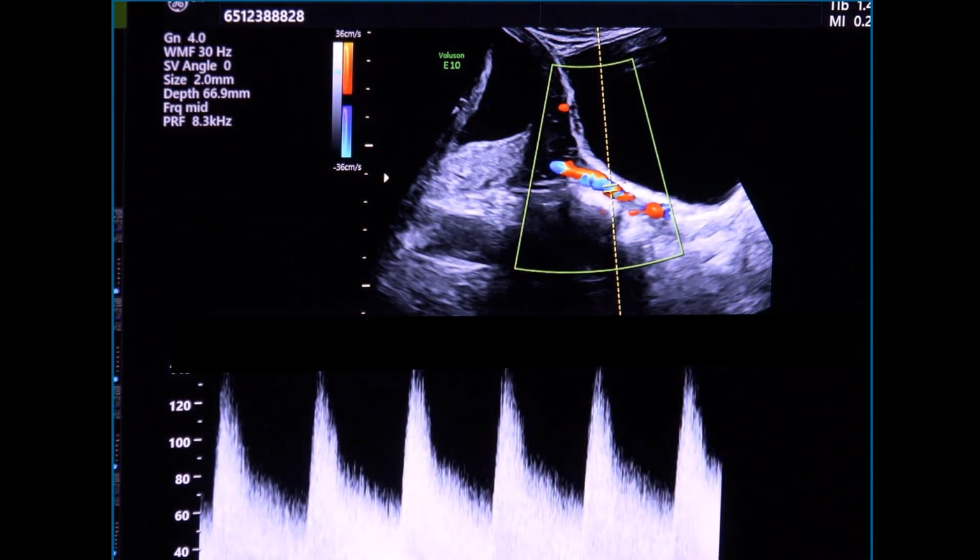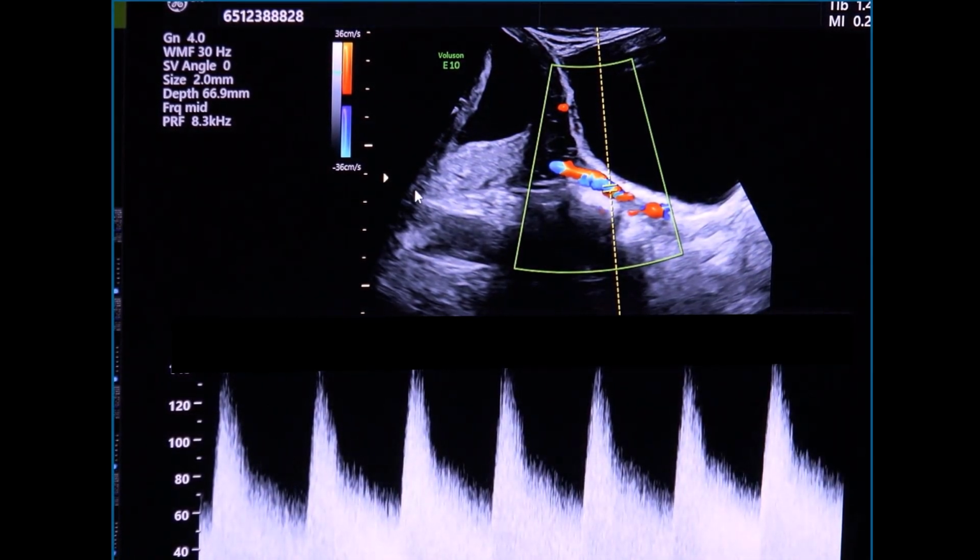And you can hear that the uterine artery waveform has this beautiful distinct noise. I call it the seashell noise, so it's a shh. And what you should aim to get is anything between 5 to 10 beautiful waveforms, and then you measure the best 3, which we will do now.